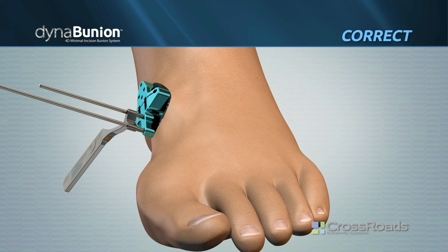Using the joystick, assess the rotational mobility of the metatarsal by using fluoroscopy to assess the distal metatarsal and sesamoids. If needed, a lateral soft tissue release may be performed. Make a small stab incision just lateral to the head of the second metatarsal.